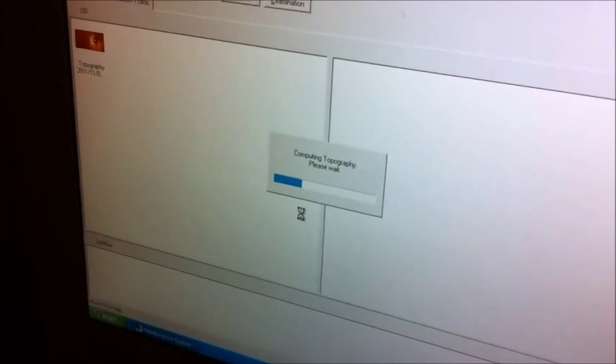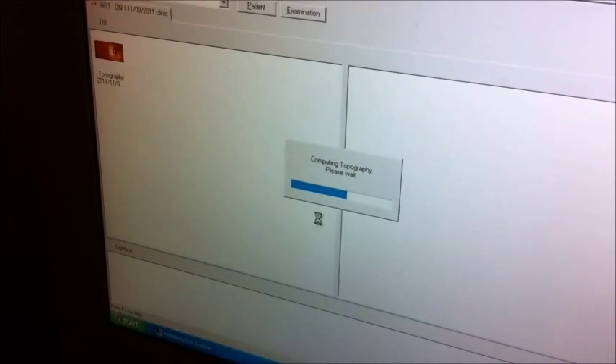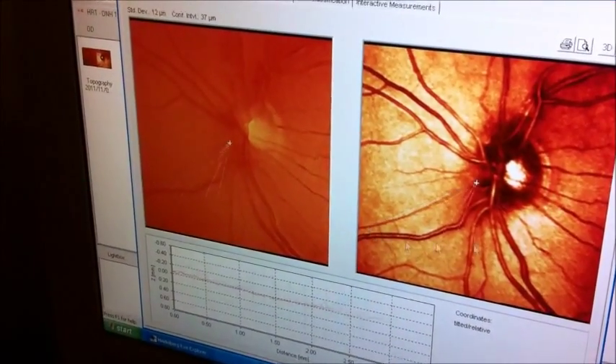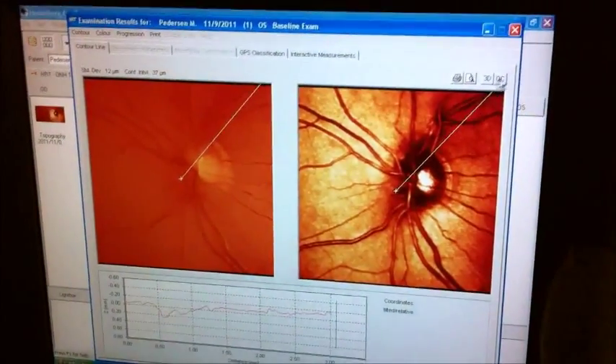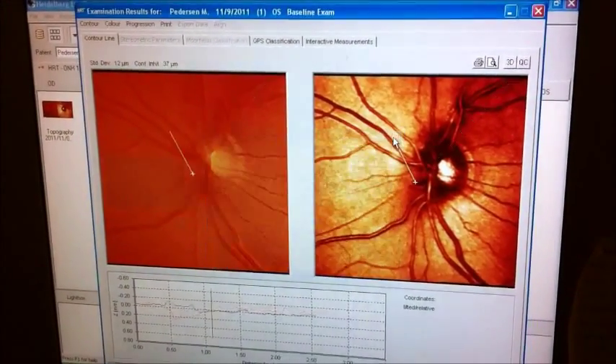We're going to have to do the same thing with this eye — set the parameters for the optic nerve head. What's really nice about the HRT is it actually gives you an indication of whether the nerve is small, medium, or large. We can look at the 3D rendering, and we can also look at a quality control check, so it tells us in general what the quality of the image was.